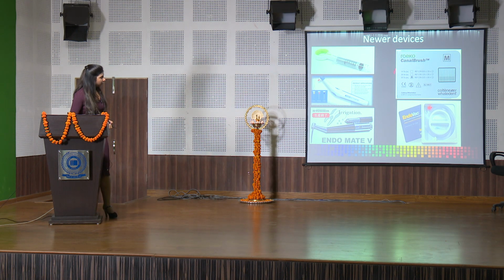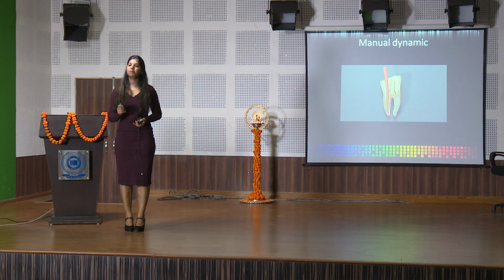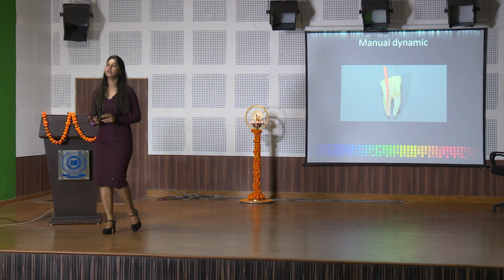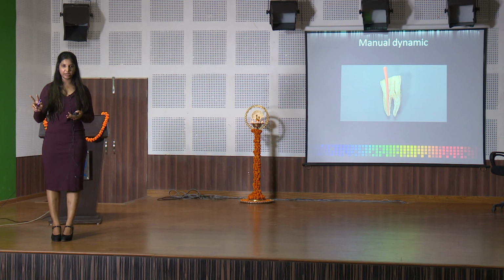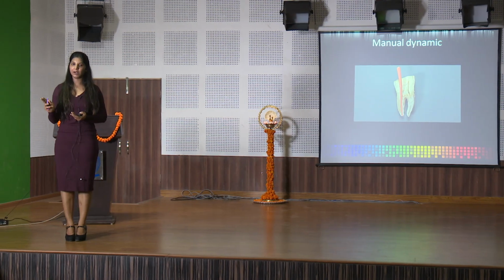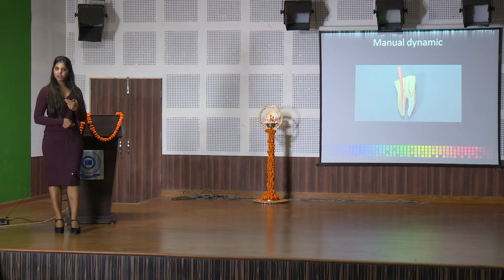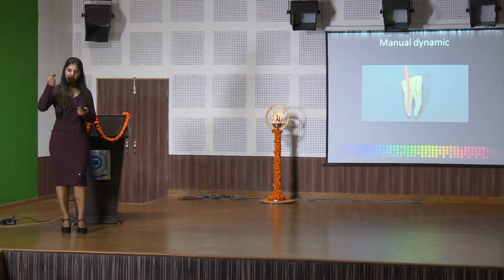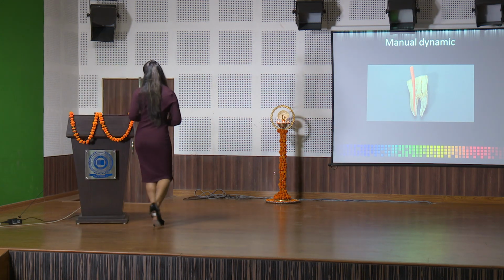So it can be done either with this or one of these expensive things, or after your entire protocol of shaping and cleaning is done, you can use your master gutta-percha for doing something known as manual dynamic agitation. Once your entire shaping and cleaning is done, use your regular protocol of irrigants in the root canal. Never mix any two irrigants. Saline is supposed to be there always in between the two irrigants, because mixing of two irrigants is bad. It will either form a precipitate or nullify the efficacy of the other. With manual dynamic agitation, once we have introduced the irrigant into the pulp chamber, we take the master cone, put it in the canal and start agitating it. Do it for 1 minute each canal and your apical third is taken care of.